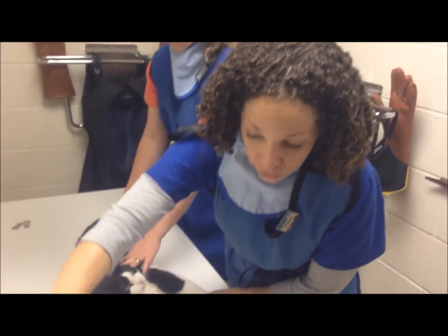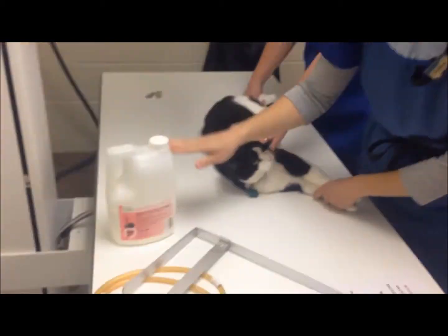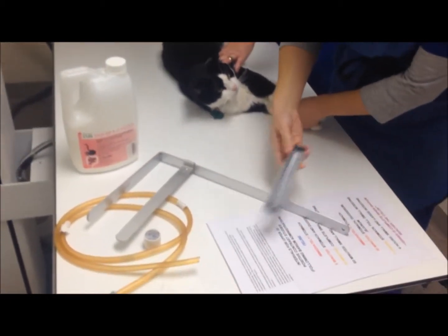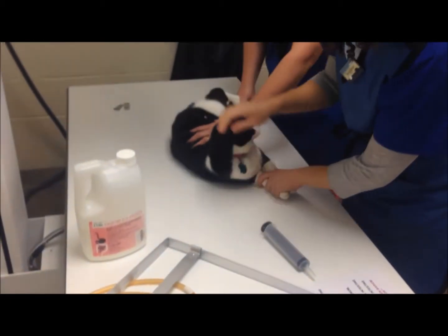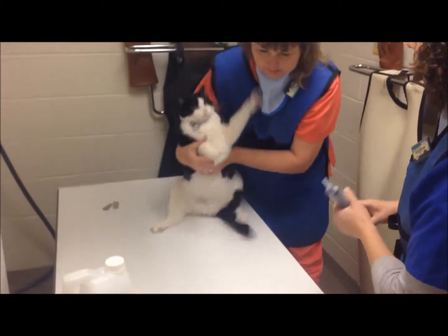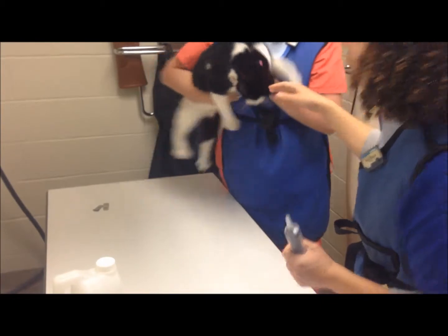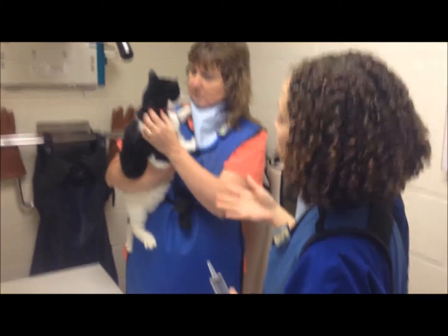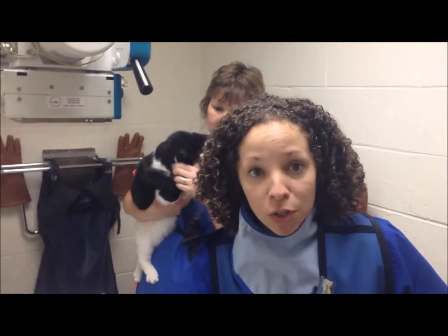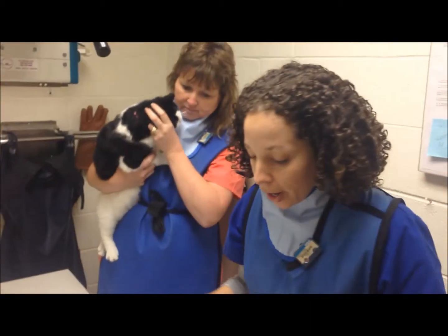As I mentioned before, we're using the barium sulfate suspension 60%, and we will draw up her calculated dose, which again, based on her weight, is roughly going to be between 40 and 45 mLs. We can either give that to her orally, if she'll tolerate that, or we can actually use this gastric tube to insert it a little bit farther down her GI tract.